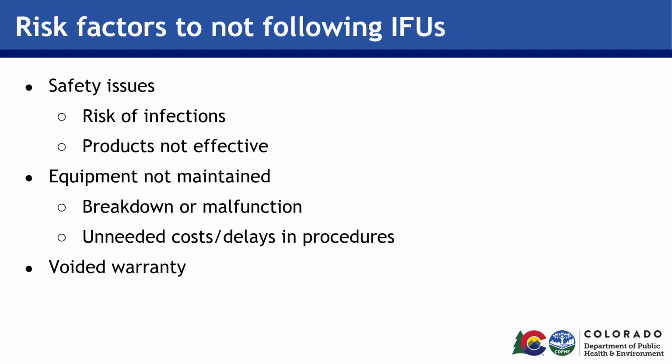Risk factors to not following IFUs. We'll now go more in depth with what some of the risk factors are of not following IFUs. You will find that IFUs often come with warnings that if diverting from their specific instructions, it can lead to issues in safety. One of the biggest safety concerns when not cleaning or disinfecting items like shared medical equipment properly is putting your patient or resident at risk for infection.